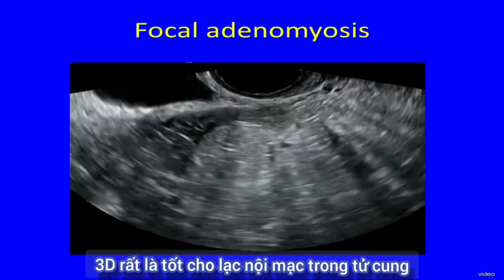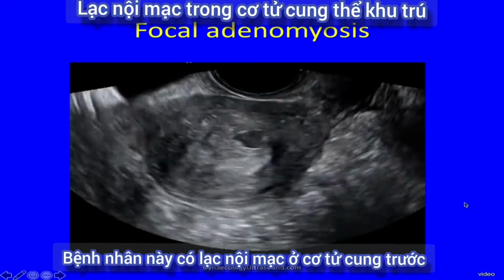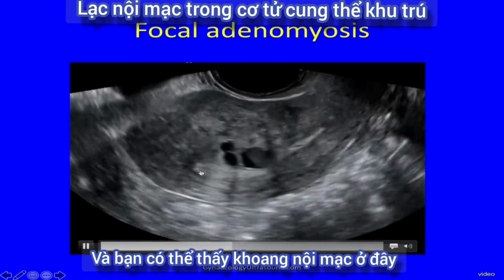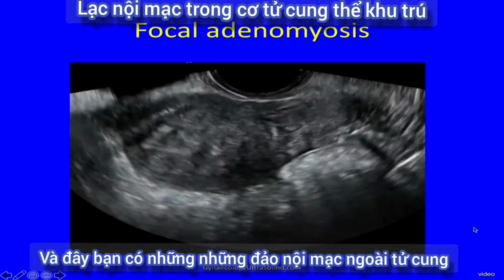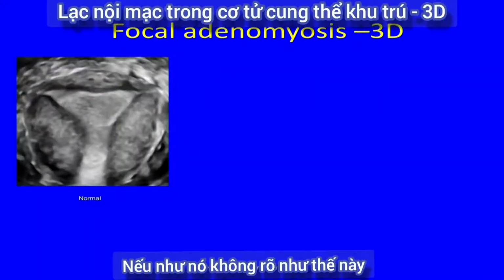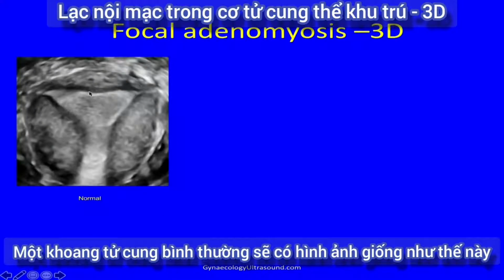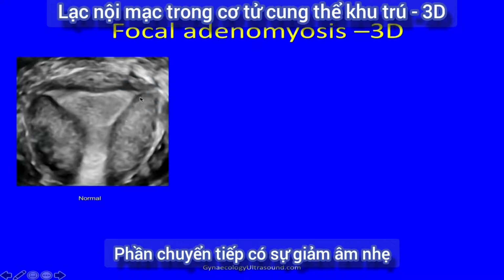3D is very nice for adenomyosis. So here this patient has adenomyosis in the anterior myometrium, and you can see the endometrial cavity here, and here you've got these islands of ectopic endometrium and areas of hemorrhage into them. If it's less clear than this, this is what a normal cavity would look like, where you've got the endomyometrial junction here, this slightly hypoechoic, almost transitional junction.